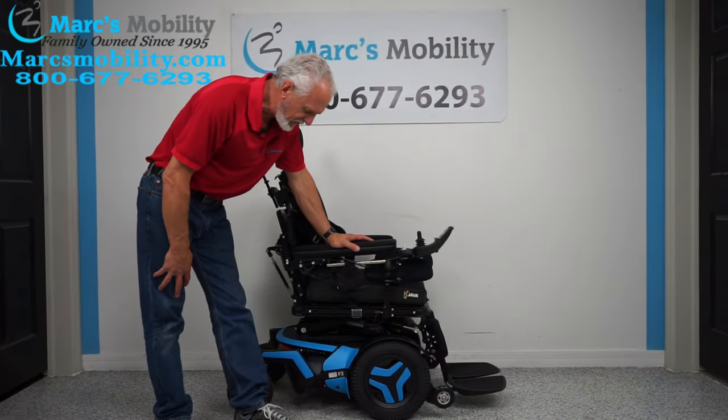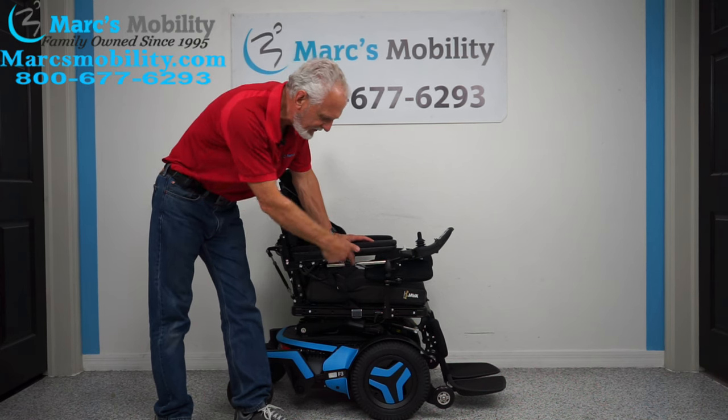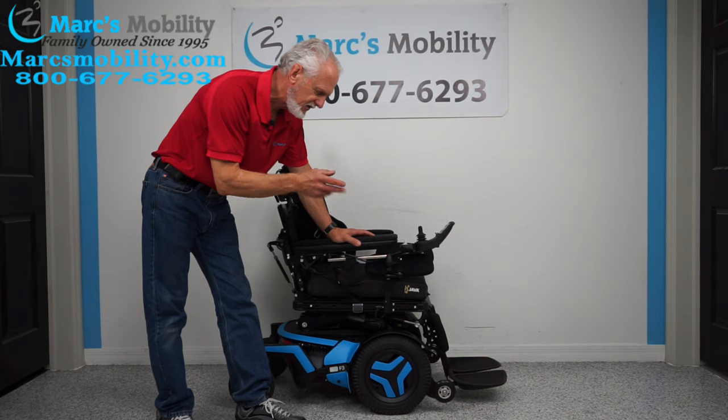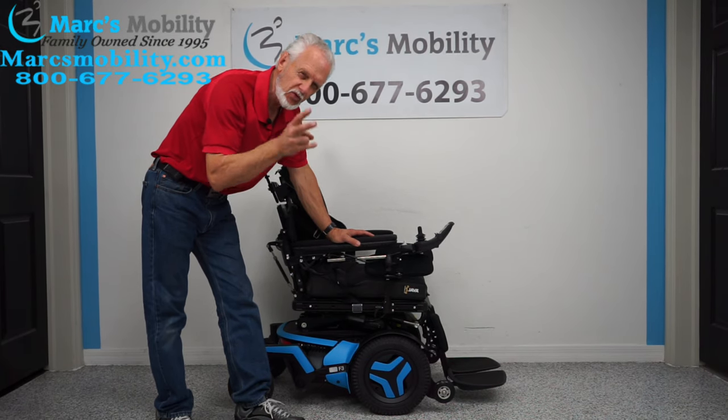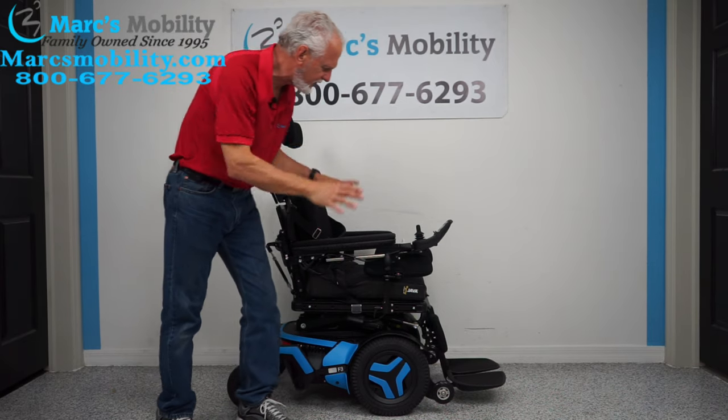A beautiful blue Permobil F3 power chair. FD stands for front wheel drive — F3 power chair. This is a gorgeous chair. This chair only has 28 miles; it was used for maybe two months. It has gel arms and all kinds of goodies on here.